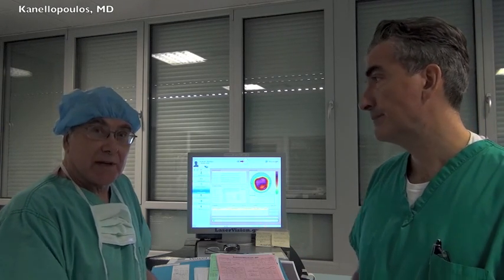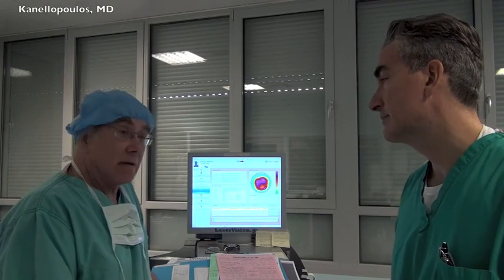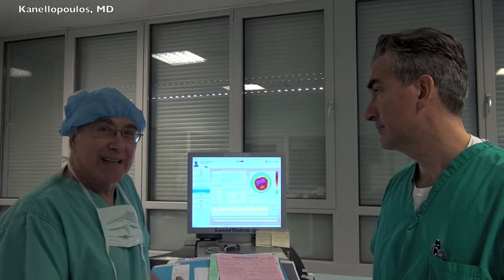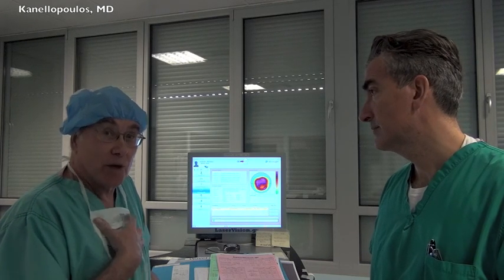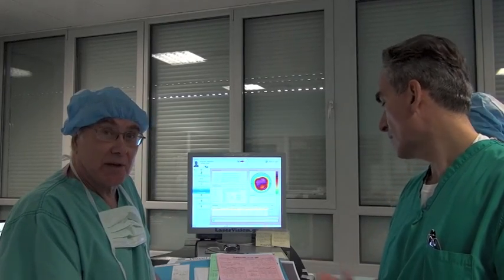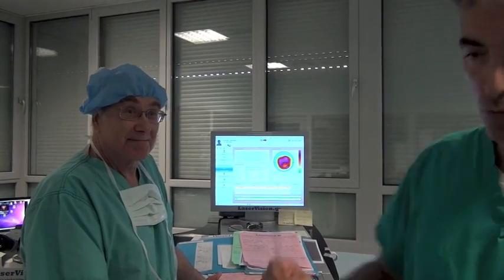And this is one of the things that I've learned in studying with Dr. Kanellopoulos: the actual outcome is what the patient sees. We know that, but we're dealing with topographies here that don't really tell us what the patient's vision is. Good. So we'll get started right away.